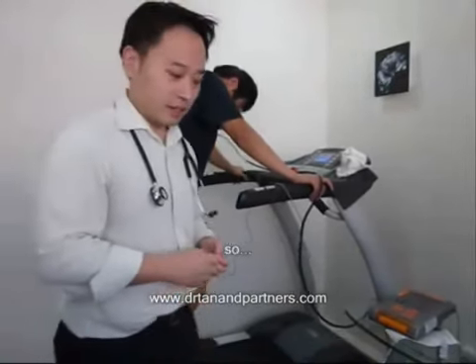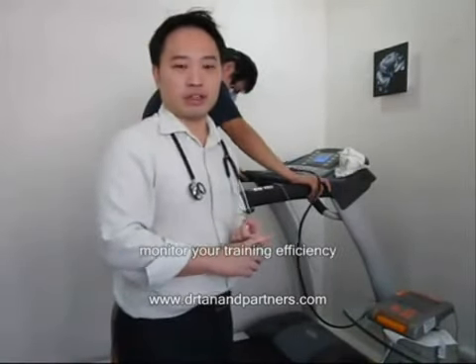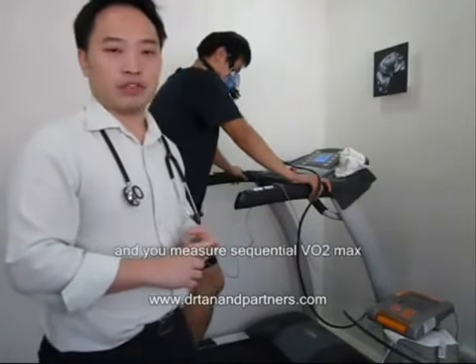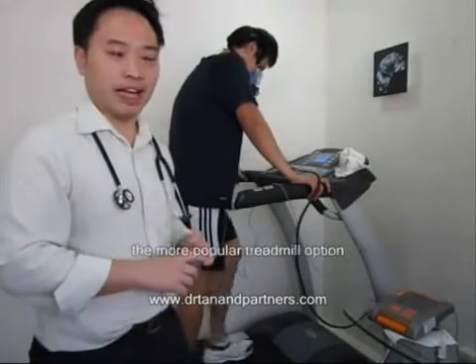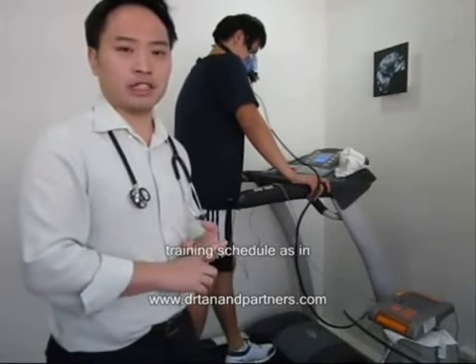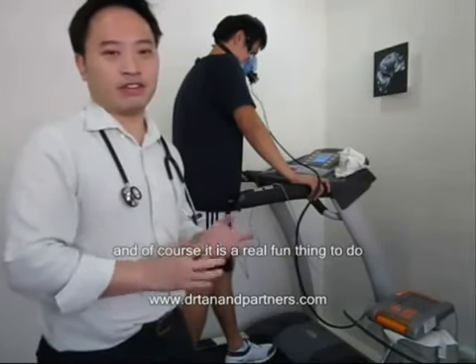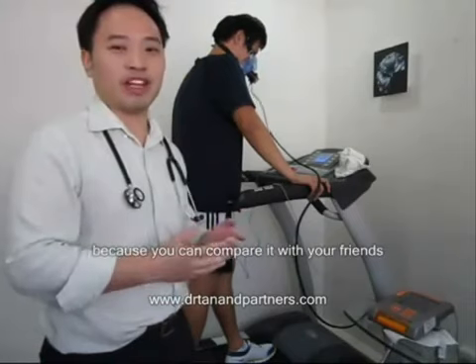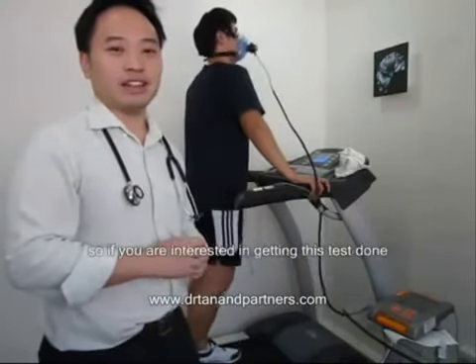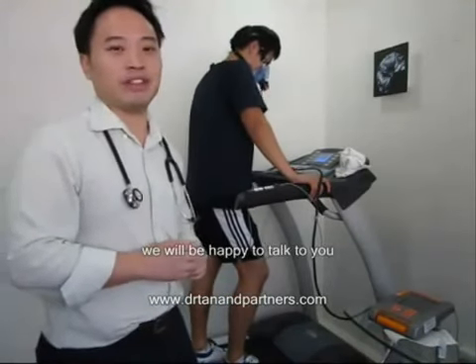The possible usages of the VO2 max would be to monitor your training efficiency — if you are training well and you measure sequential VO2 maxes, you should see an improvement. It can also contribute to planning your training schedule, as in how fast and how hard you should be training and running. And of course it is a fun thing to do because you can compare it with your friends and with professionals around the world to see where you stand. If you are interested in getting this test done, come down to our centre and we will be happy to talk to you.